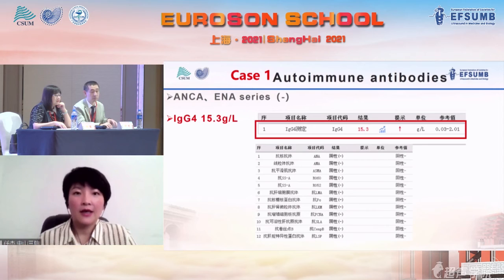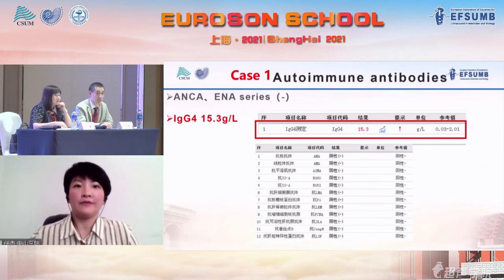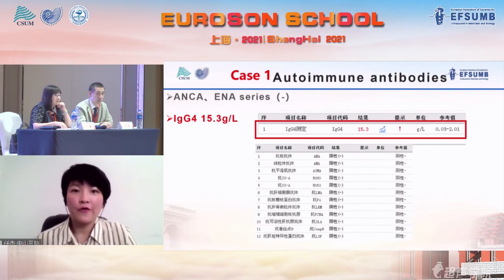This patient had another examination. IgG4 was tested and revealed an elevated level, and because we think this is IgG4 related cholangitis, diagnostic treatment was also given. Please next.